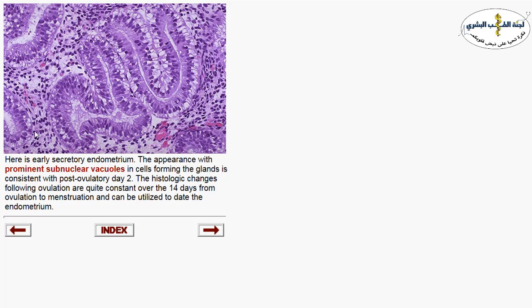The secretory phase is a constant phase within the endometrial cycle, starting at day 14 and lasting 14 days. Here you can see endometrial glands lined by columnar cells with sub-nuclear vacuoles — sub-nuclear vacuolization containing secretion. This represents endometrium with secretory changes and is the characteristic appearance of secretory phase endometrium.